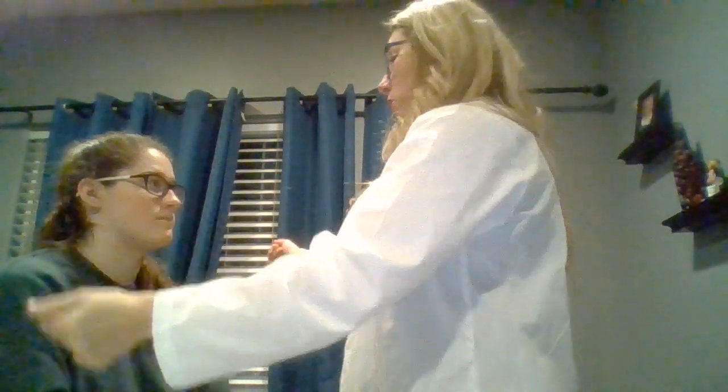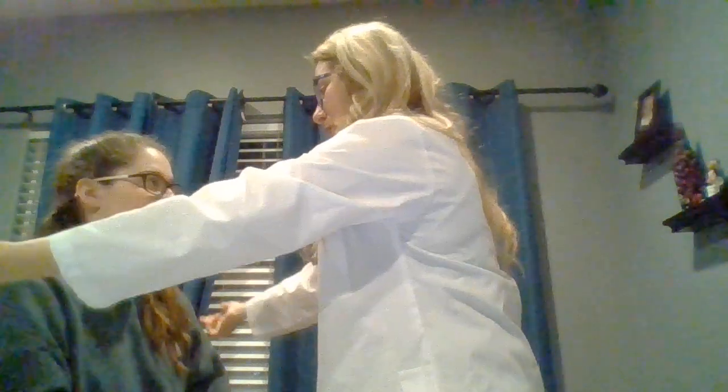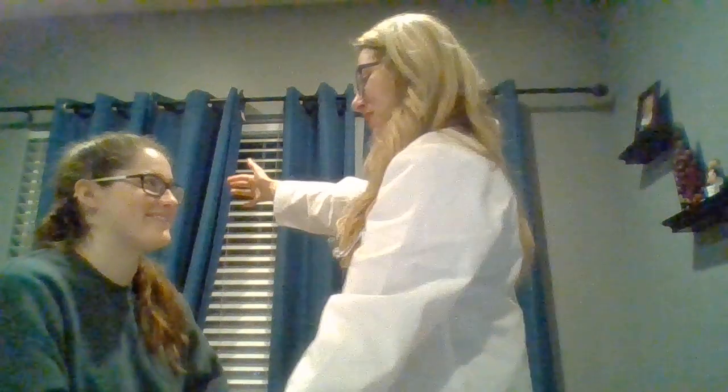Now I'm going to be assessing your peripheral vision by confrontation. Okay, so you let me know when you can see my fingers, okay? Yeah, I can see your fingers. Okay, and then I'm going to do this side. I can see your fingers. Okay, good. Now I'm going to use my ophthalmoscope. Okay, now take off your glasses again.